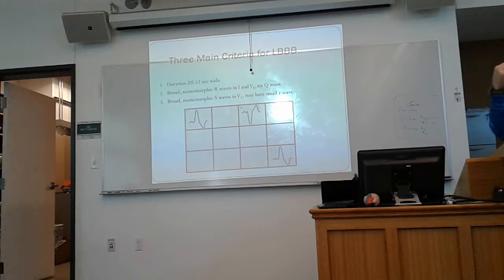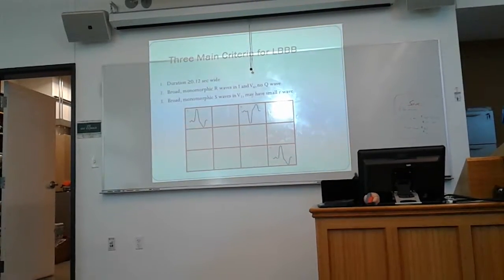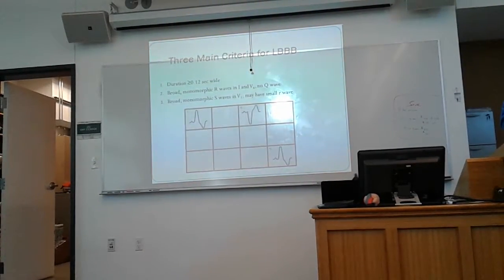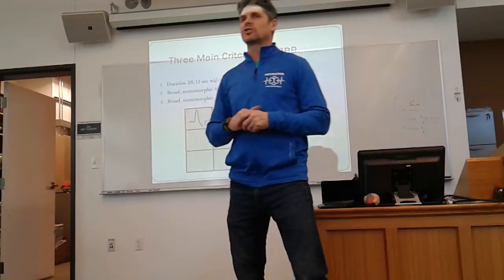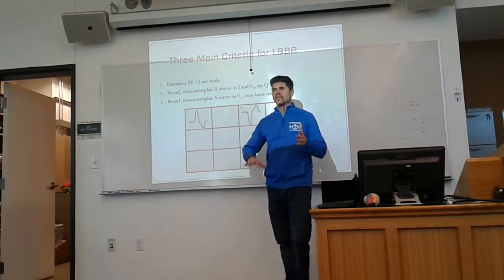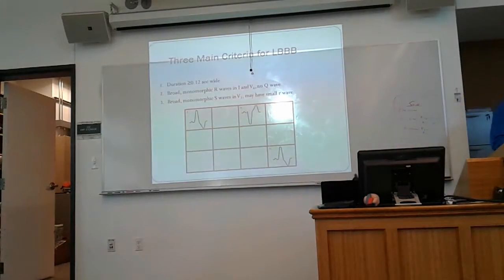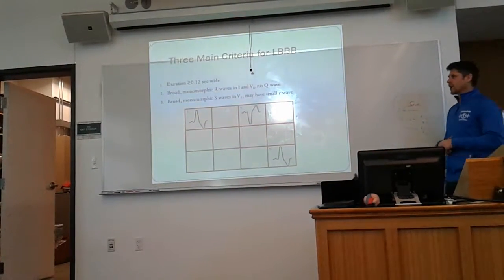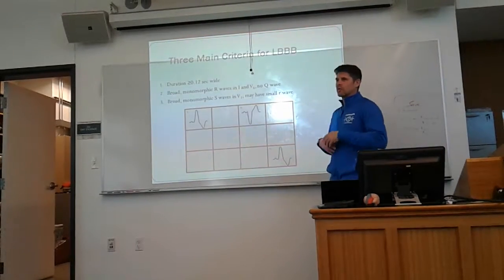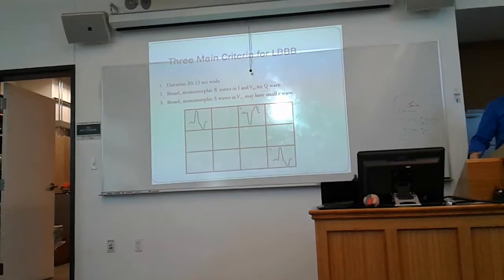So for this particular patient, having seen AVL first would have been a benefit to you because it would have steered you down the supraventricular path faster than if you'd been looking in lead 2. Does that make sense? That's my plug for you, just to try to wash away your preconceived notions that one lead is the only thing you should be looking at, even though it's the lead that our monitors often set in, right? Remember that your monitors can often look in 2 or 3 leads at the same time, so have more leads displayed.